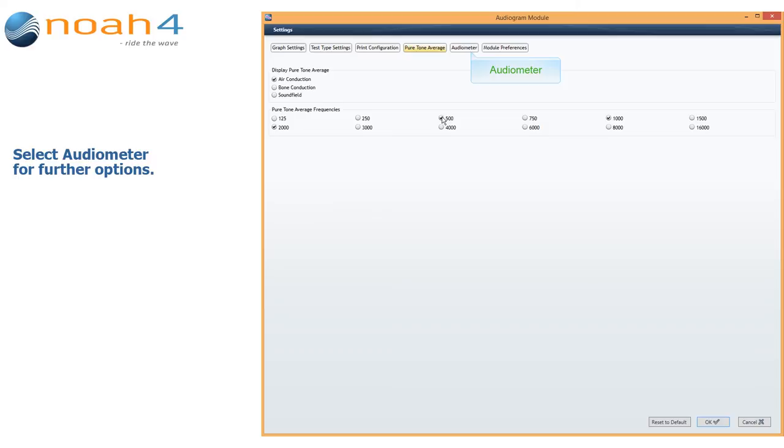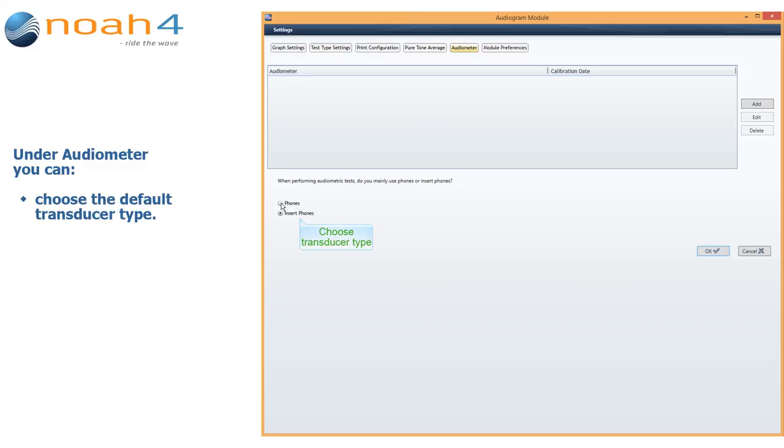Select Audiometer for further options. Under Audiometer, you can choose the default transducer type.